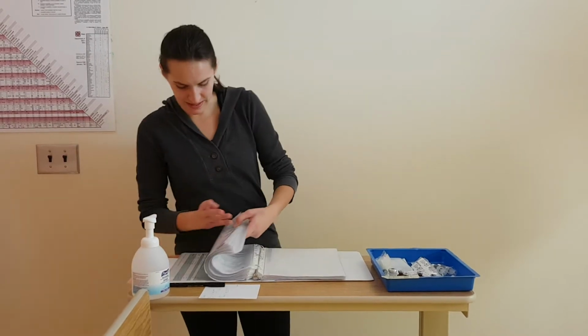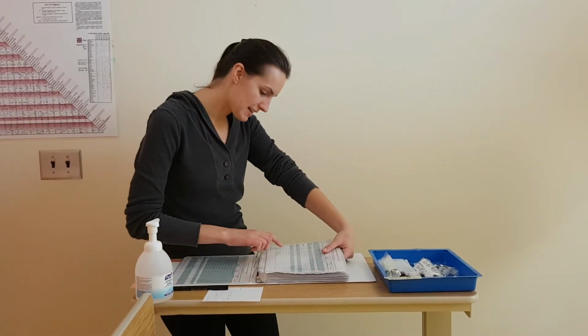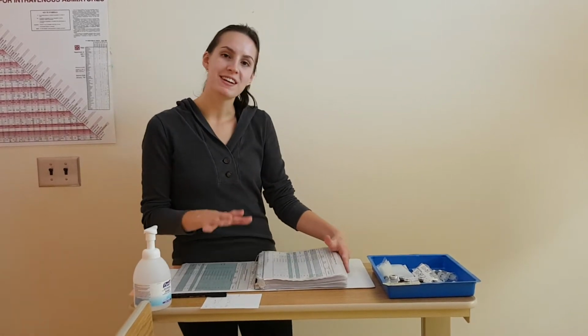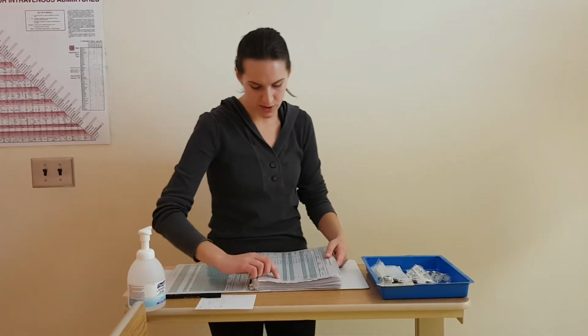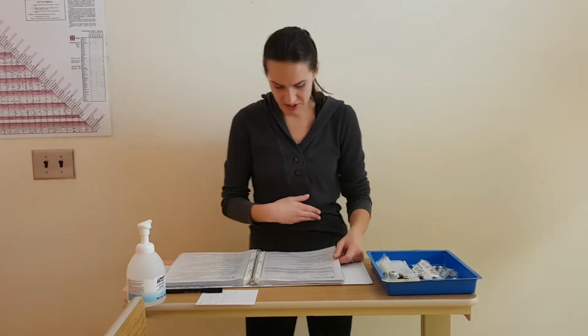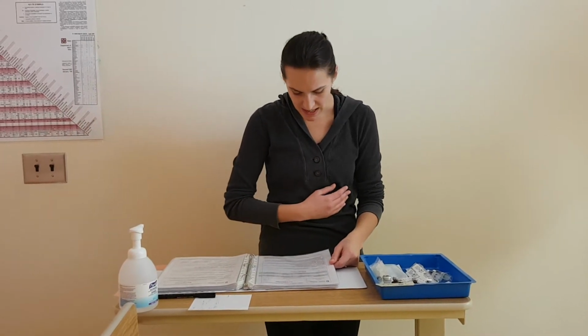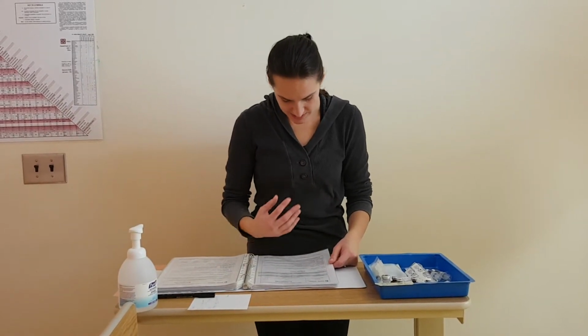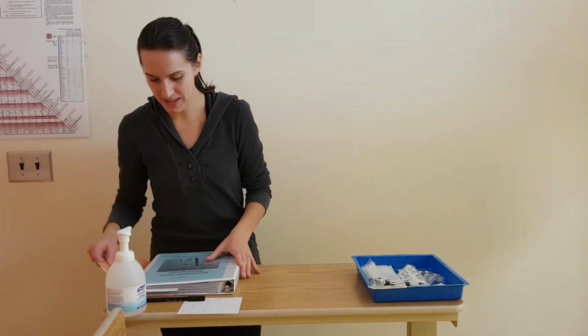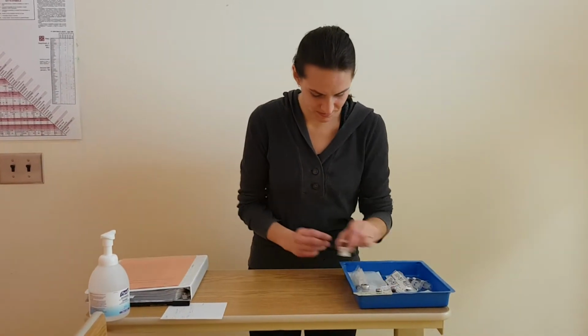And since I'm giving it via CIVA, I'm going to go to my CIVA chart, and I see here that a 40 milligram vial is to be given 5 milliliters in a 10 milliliter syringe on the pump setting of normal and administered over 13 minutes. I also note some potential hazards, and these are things I would let the patient know of, or side effects that they may expect. Things such as dizziness, headache, restlessness, loss of appetite, nausea, etc. So I'm just going to close this up, and I'm going to begin by preparing my medication here.